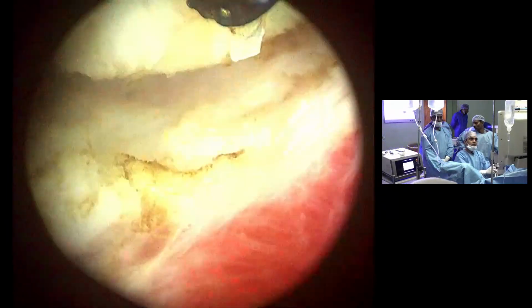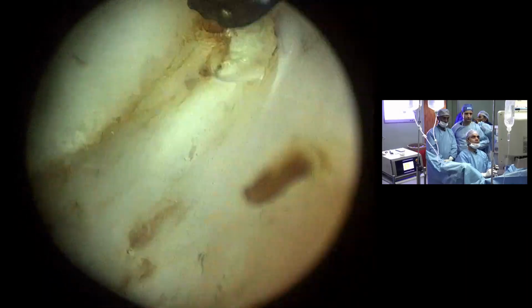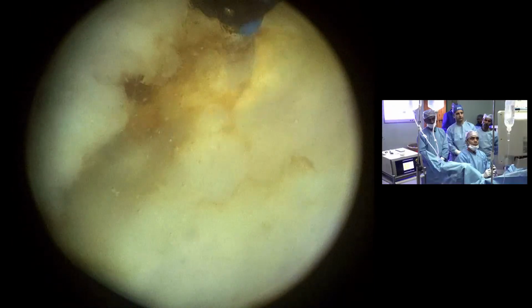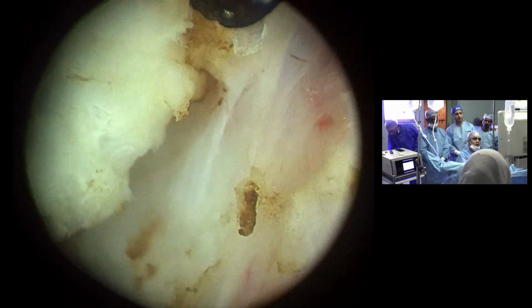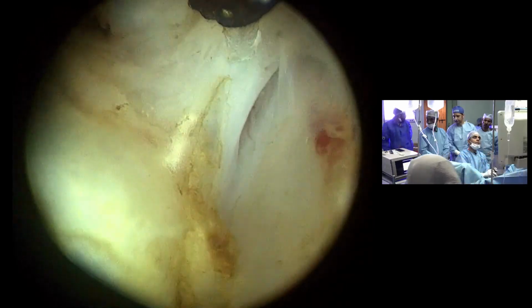During a procedure, for a beginner who is still in his learning curve, should he convert to a standard TURP once he is on the journey of learning enucleation? See, TURP also has a learning curve. So yes, for people who have to start, you have to first start with TURP. In the learning process, you can just do the median lobe initially. Once you have done around 10-20 median lobes, then you can start with one lobe. The other you can resect, and then you can wait for your morcellator to come and complete the job once you have the entire armamentarium. Something like that.